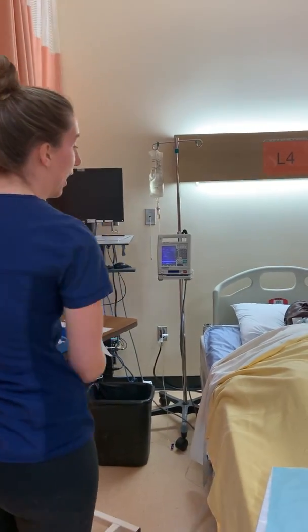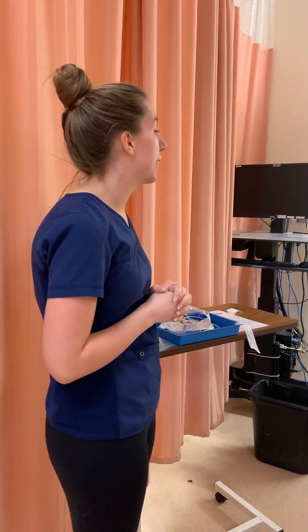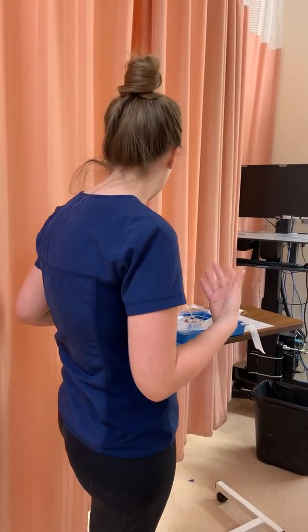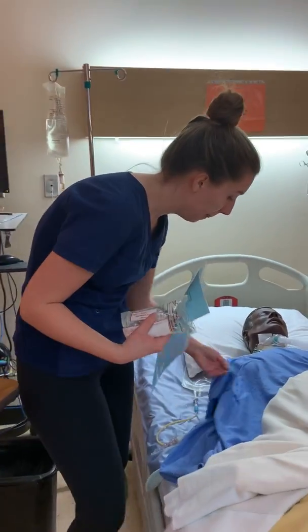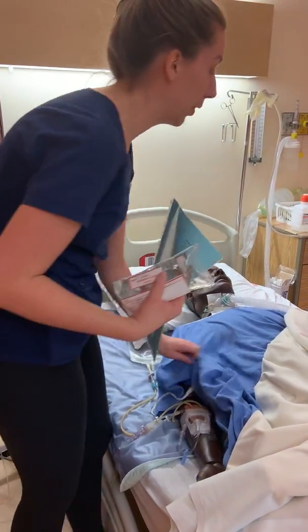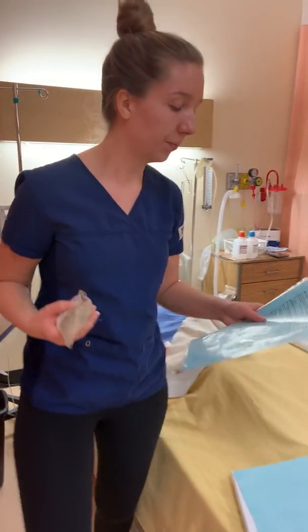Hello, my name is Mikaela and I will be your student nurse today. As I'm walking in, I'm performing my safety check. I can see my patient's not in distress, the call bell's in reach, and the bed's in the lowest position. I'm going to start off by doing my third check. So I'm going to come over and look at my patient's wristband here. And I'm going to check their other arm for their wristband.